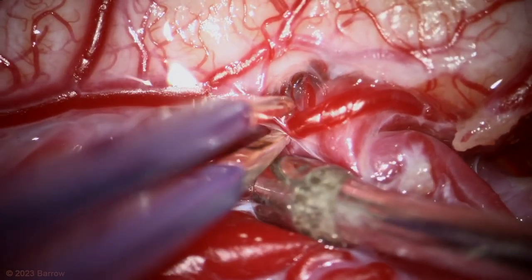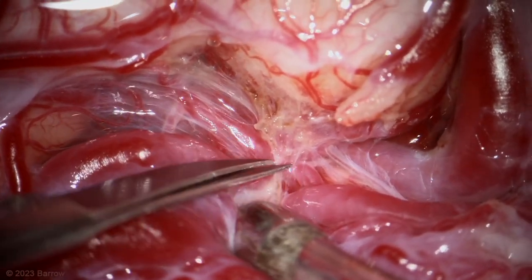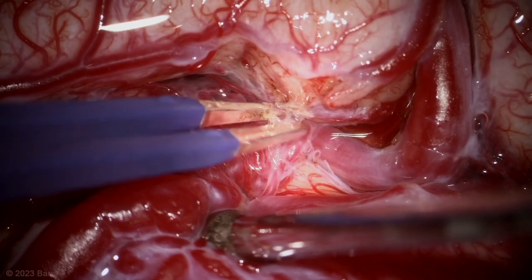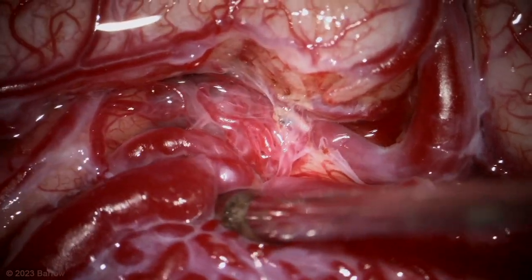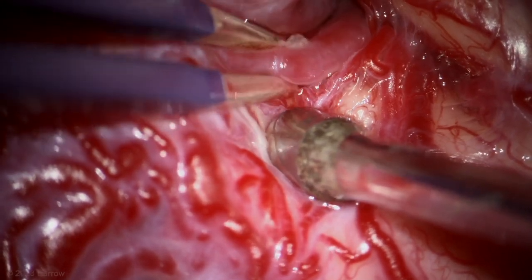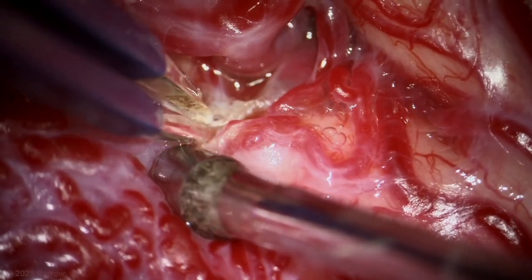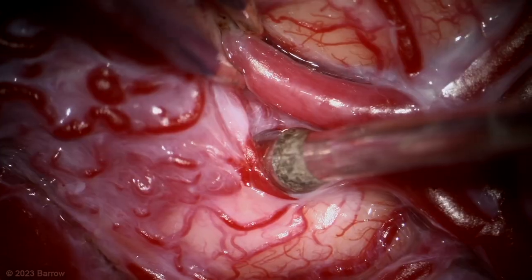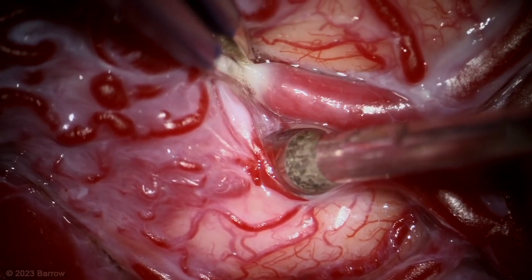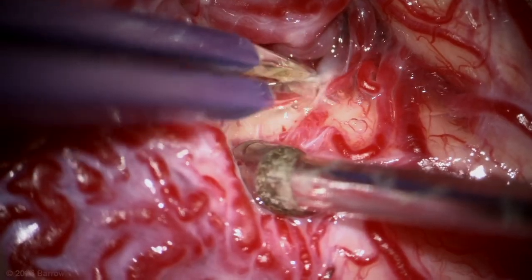Next, attention is turned to developing the margins between the borders of the AVM and the adjacent gyri and sulci. This AVM had beautiful sulci with very large feeding vessels that came up through them, and as I trace them to the border of the AVM, I take them right at the edge of the nidus. It's important not to take these too distant from the AVM because sometimes they loop and turn out to be bystander arteries.